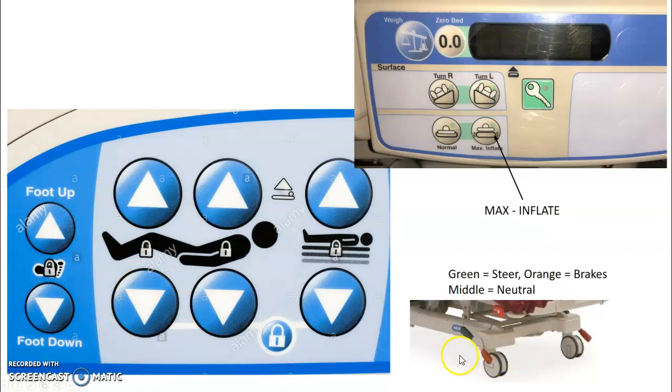The locks on the stretcher work similarly. Usually green is steer, orange is the brake, and anytime it's midline it's considered neutral.